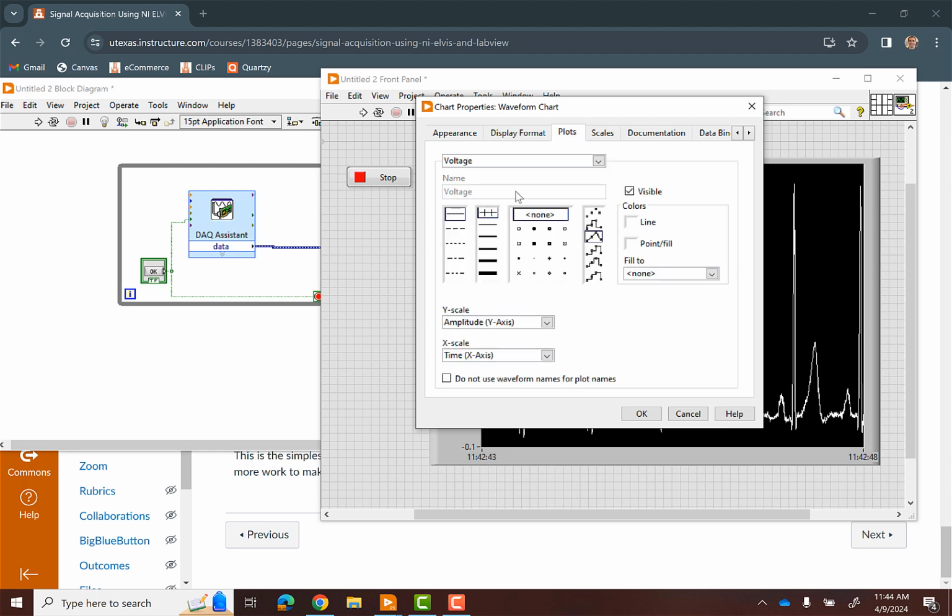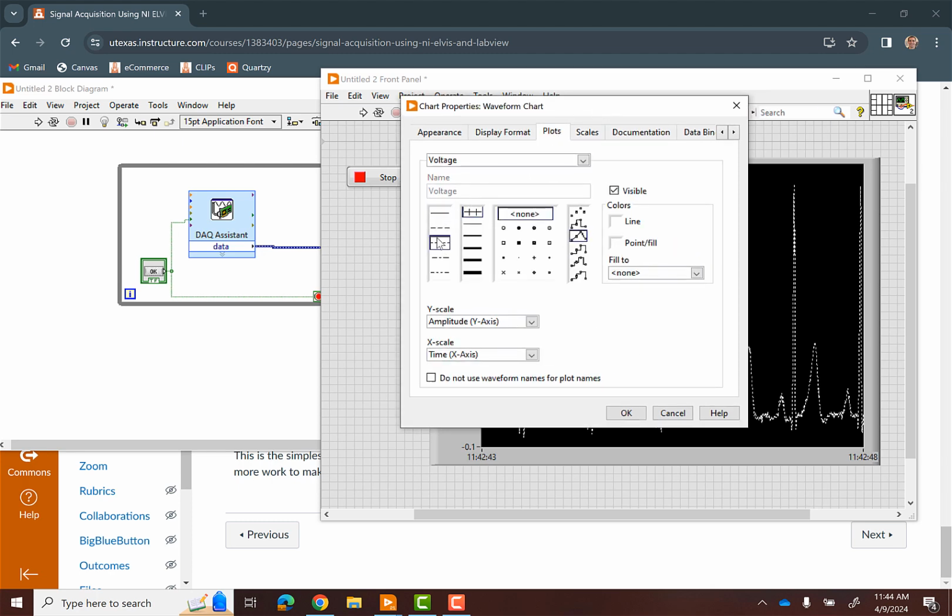And then plots, you can change how your plot looks, right? You can change if you want dotted lines, solid. If you want it thicker, you can do that. Or if you want to put points on there, which we don't want to do, you can change colors, right? You can put some fill in here. Probably don't want to do stuff like that.